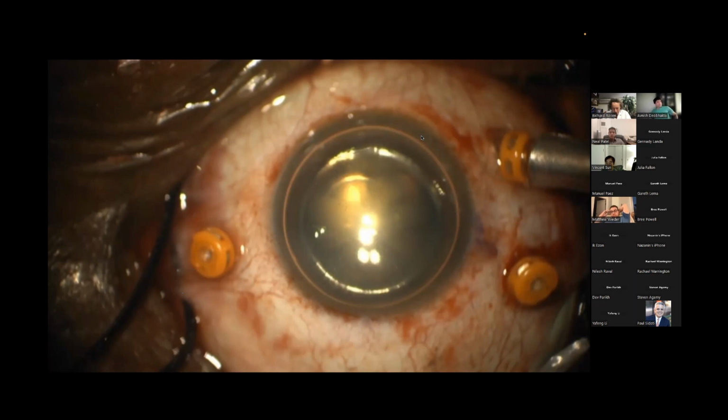We had cases, actually, I would like to report. We have maybe 5 or 6 cases, and I already mentioned it before, when for some reason something happened to the lens, iatrogenic or other reasons, and we had to remove the lens when the eye was just a regular PPV with the gas, and we needed to do cataract surgery 9 days, 12 days after the PPV. We removed the gas 12 days later, 9 days later, and we did the phaco, and all the patients did great, nobody redetached.